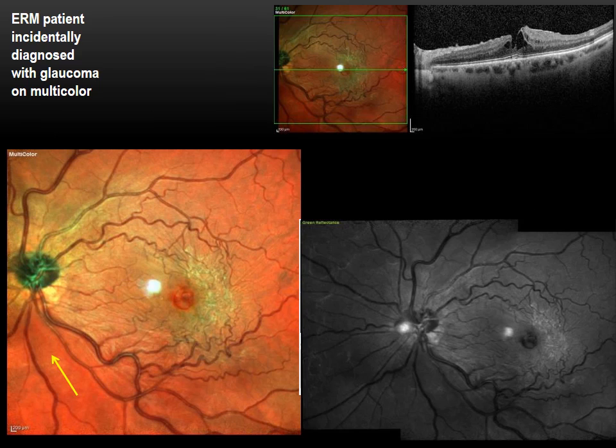This is an example of another epiretinal membrane patient, again incidentally diagnosed with glaucoma on multicolor. This patient with an epiretinal membrane and a lamellar hole was being evaluated by a retina specialist when they noticed that the reflectance of the nerve fiber layer thickness superiorly was different than the reflectance inferiorly. And one can see this dark band here. This inferior portion shows loss of nerve fiber layer thickness despite the absence of cupping in the optic nerve.